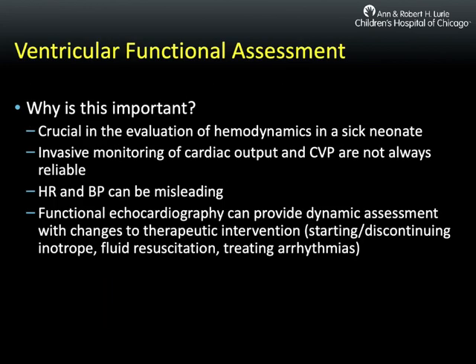So why is ventricular functional assessment so important? Well, we know that it's crucial in the evaluation of hemodynamics, particularly in sick neonates. We know that measuring cardiac output through invasive measures, as well as direct CVP measurements, are not always reliable, as well as vital signs at the bedside, such as heart rate and blood pressure, can be quite misleading. So functional echocardiography really can help provide a dynamic assessment with changes to therapeutic interventions, such as starting and discontinuing inotropes, fluid resuscitation, and treating arrhythmias.